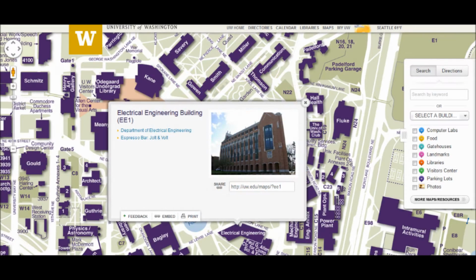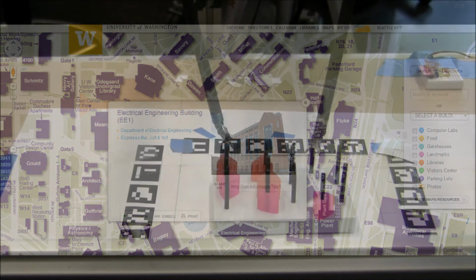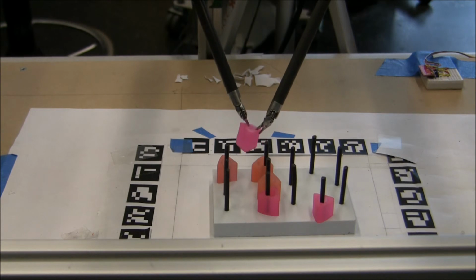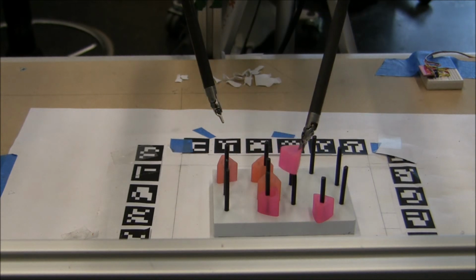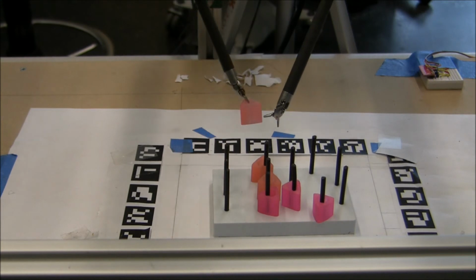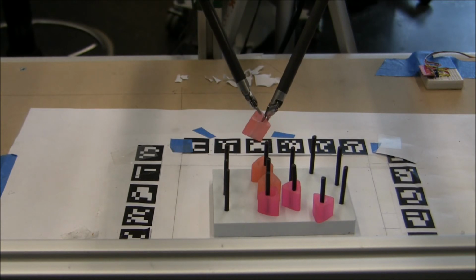This email will also include instructions on the location of the laboratory that houses the robotic system you will be working on. This concludes the Raven training module. Feel free to watch this video again if you need to review some of the concepts of how to use the Raven. And don't worry, you'll get plenty of time to familiarize yourself with the surgical robots and their controls prior to beginning any timed task.